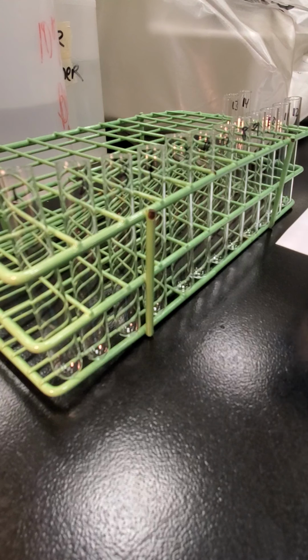So we are going to be using these two reagents in the QC kit against our reagents to make sure that they're working properly, to make sure that our tests are being completed properly. I've also uploaded an interpretation chart of the QC results. So those are our expected QC results. During the demonstration, I want you to record the reactions on your worksheet and then submit that to me.